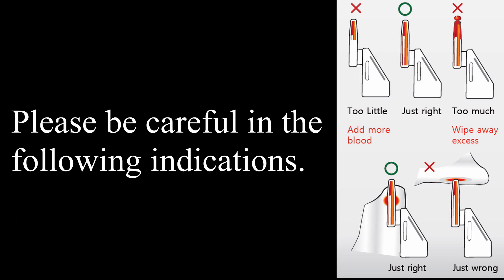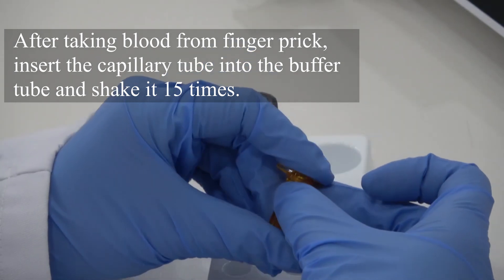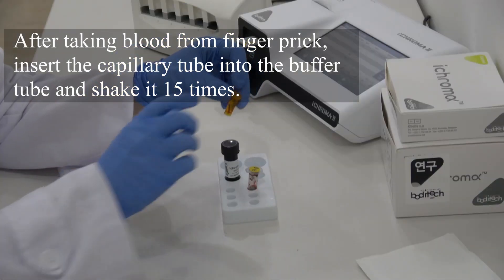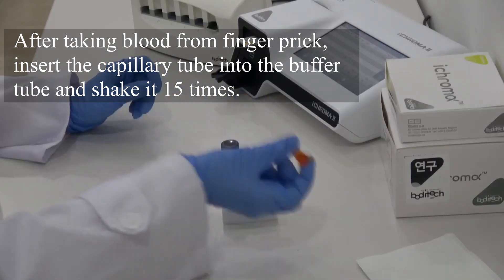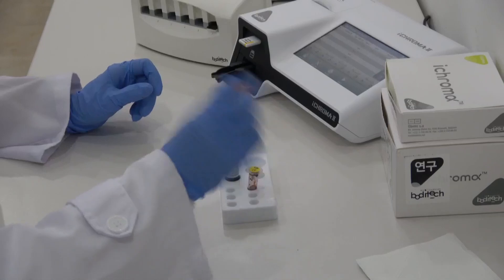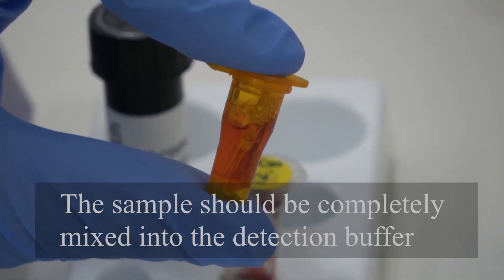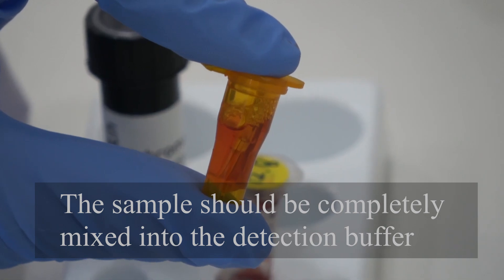Please be careful in the following indications. After taking blood from the finger prick, insert the capillary tube into the buffer tube and shake it 15 times. The sample should be completely mixed into the detection buffer.